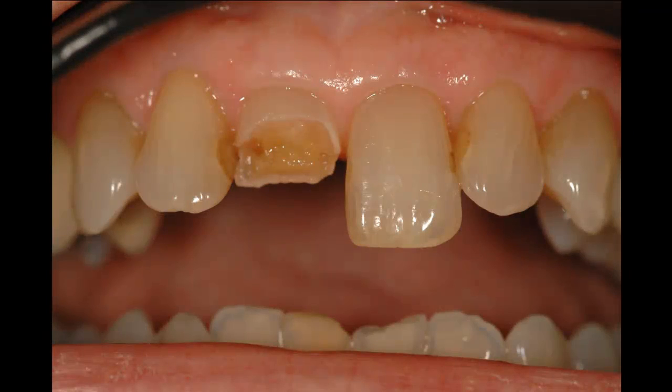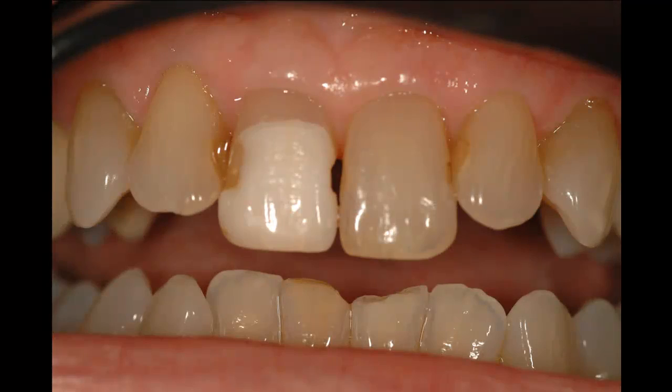Here she is. This is how it looks as she presents, and she's worried about what she can do until she can get back and have something more permanent done. She was referred to me from one of my patients who has had a CEREC crown done, and he said that I could probably fix it in the same day. So she's beginning to wonder, can we possibly do this and just put it back on?